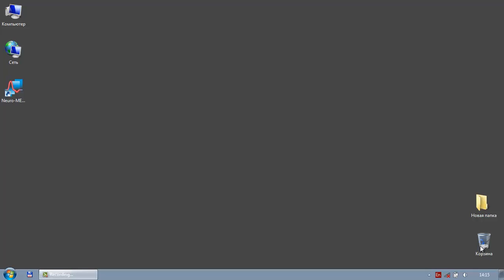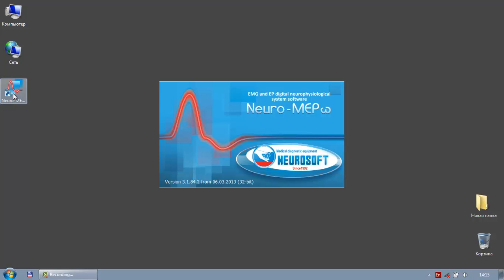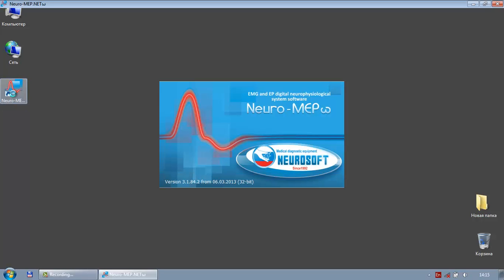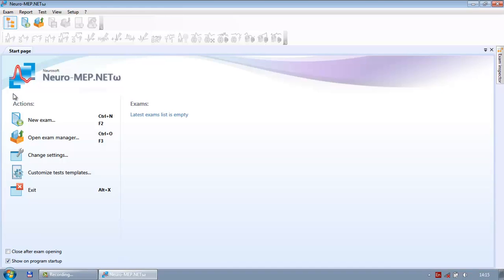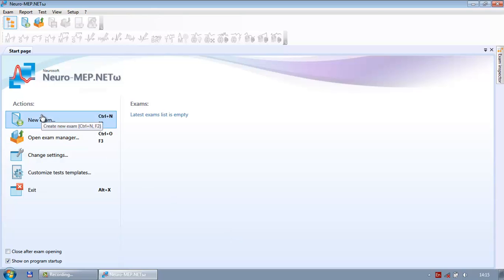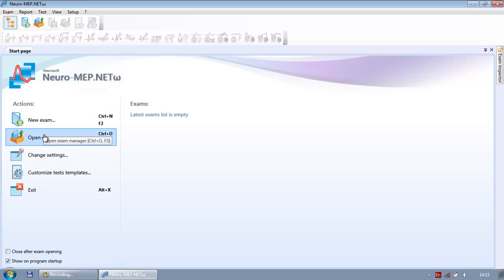Neuro MEP Net Omega is EMG, nerve conduction study, and EP testing software. To run it, move the mouse cursor to the icon on your desktop and double-click. The software is loading, and what you can see first is the main window. At the top of the main window you see the menu; below the menu you see toolbars and the so-called start page, which shows the most popular menu commands.